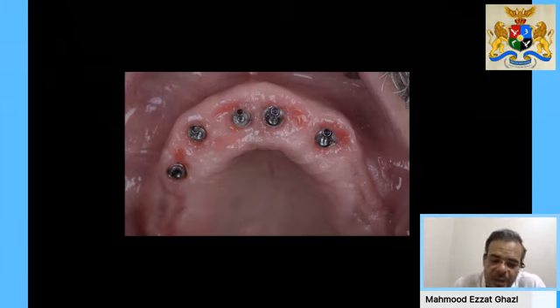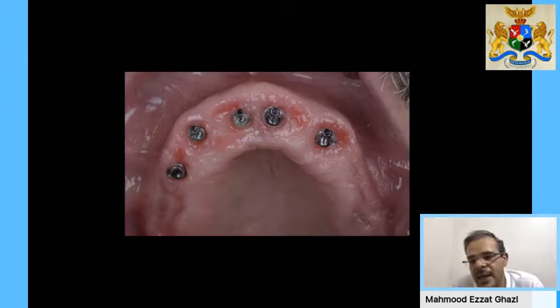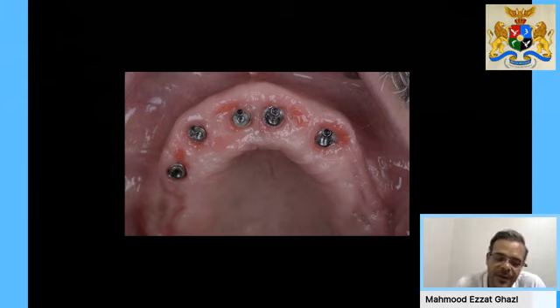You need to do verification jigs. You need to verify once more with your lab, and then only can you scan your model if you want to complete the digital way with scan bodies on a stone cast. You can never use an intraoral scan so that you can have a passive fit for your full arch restorations. And of course, this is all by studies.